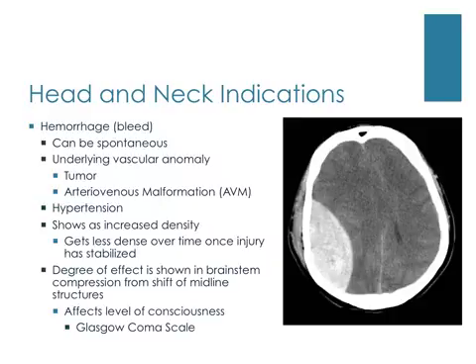With a patient who scores even as high as a 13 or 14 on the scale, though, time is absolutely crucial, as the score can decrease in less than 5 minutes if there is an expanding intracranial hematoma. The tech should alert medical personnel if he or she sees a change in the person on the table that they are scanning that has a bleed. The hematoma will get less dense over time if the patient survives and everything goes correctly in their recovery process.